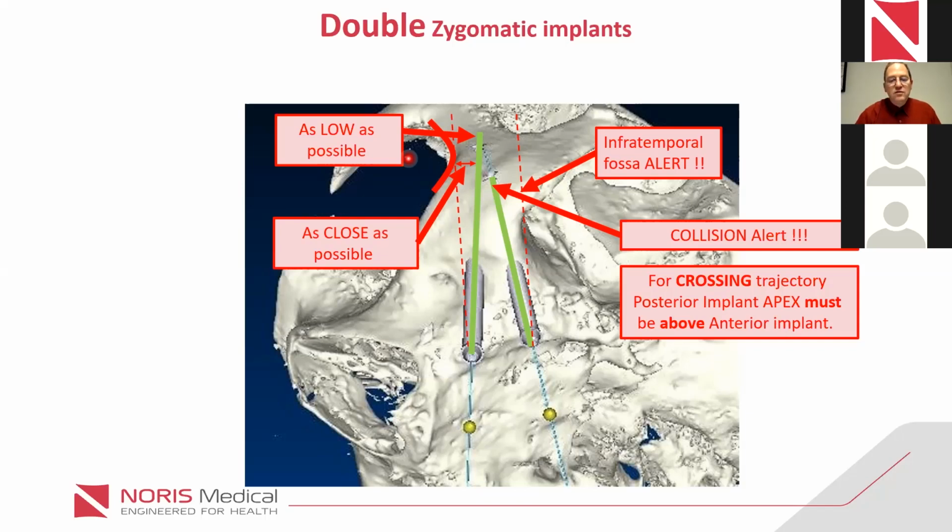Or if you did not go inside far enough with the diamond, you're way too much into the sinus and you have a bigger length here. So this length here is the parameter that you can actually measure during surgery to give an indication where you are in terms of the sinus angle. This is the only tool you have to measure that, okay?